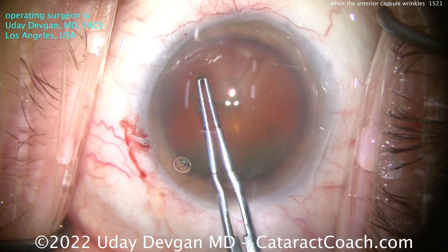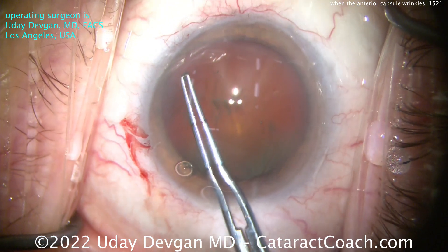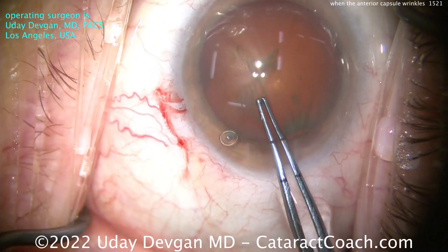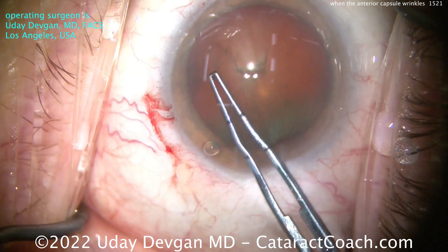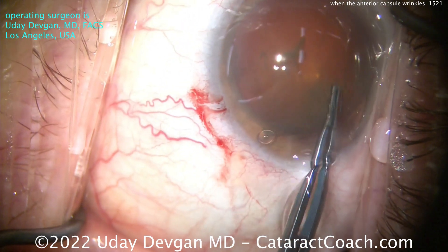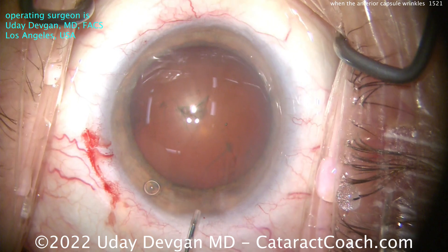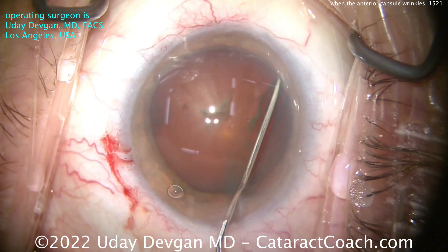This appears to me like global zonular laxity — all around 360 degrees, all the zonules are a little bit on the weak side. You can see that in certain conditions: pseudoexfoliation, maybe a history of prior angle closure, ischemia to the eye, or some kind of trauma. But typically trauma is more focal. In this case, we're keeping in mind that there is some zonular laxity.